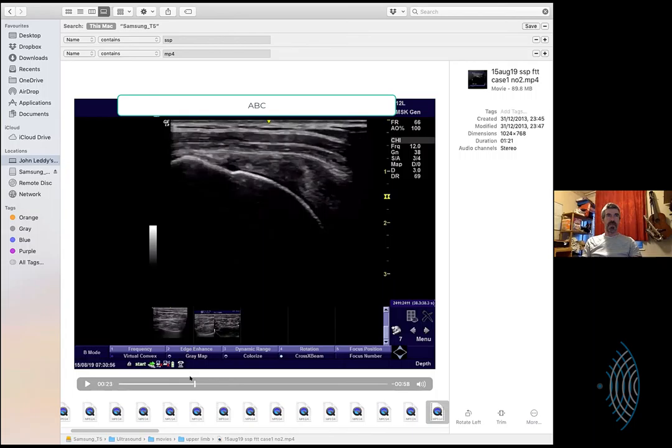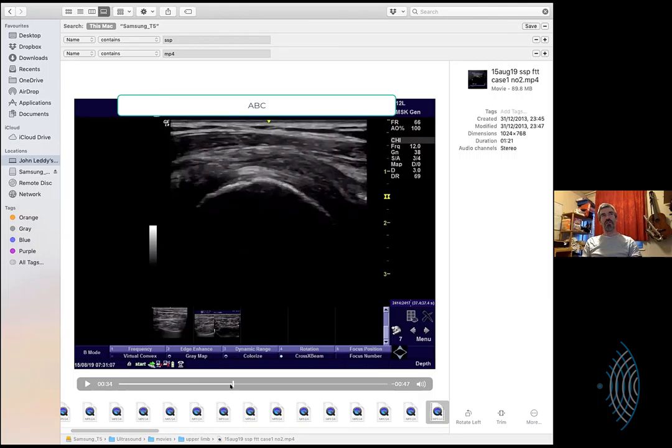Yeah. I see that. I will tell you that everything that is presently out there seems to imply that they interdigitate, at least in what I've seen, though real world is showing me differently here. Yeah, the real world is just... And I wish I had... I don't bother taking any video of normals. But you see this in normals, you can follow the infraspinatus like a tendon reaching over the supraspinatus, and you see the fibers completely patent and as a separate structure.